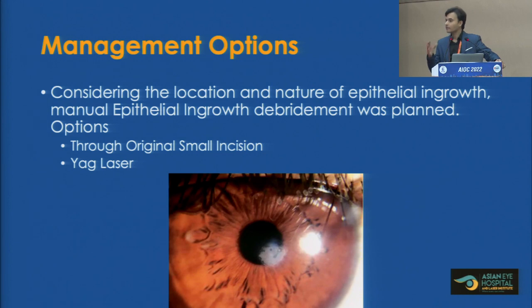Otherwise, at certain times you can see it if a lot of paracaine is used before the LASIK procedure, because paracaine is going to loosen the epithelium. If you are using especially a microkeratome to create a flap, you can slough off a bit of epithelium, which can cause epithelial ingrowth. And of course, if while repositioning the flap you have damaged the surrounding epithelium, or have not done a good job of forming a nice amount of apposition, that is another reason you can have it. Having an epithelial defect surrounding the flap is also another reason.